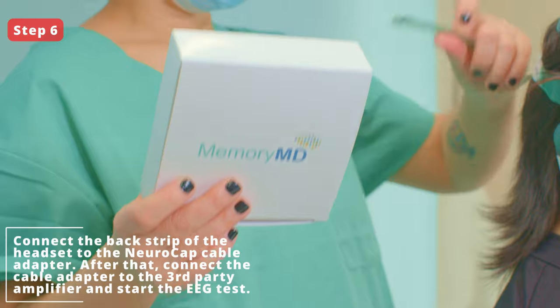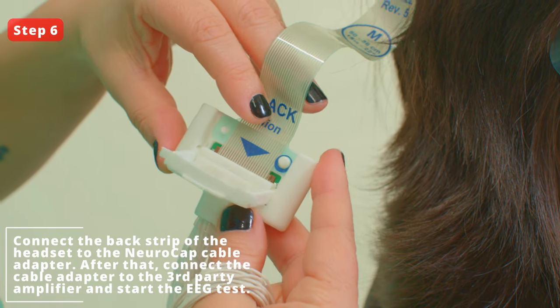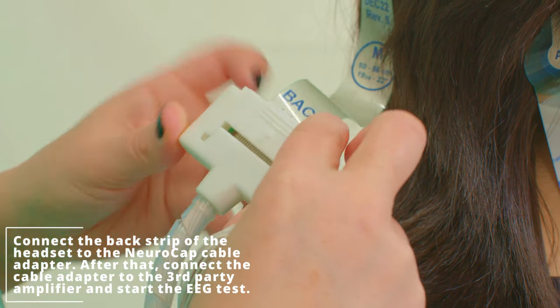Step 6. Connect the back strip of the headset to the NeroCap cable adapter. After that, connect the cable adapter to the third-party amplifier and start the EEG test.